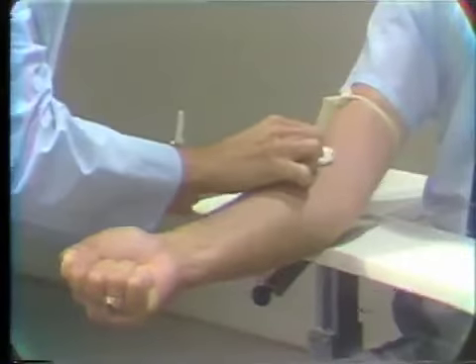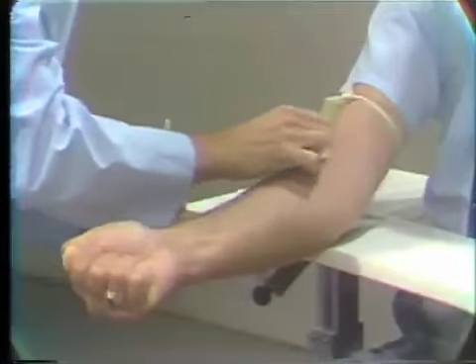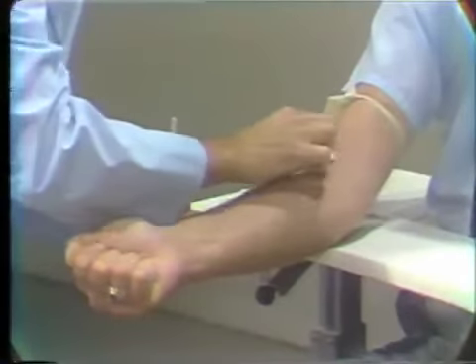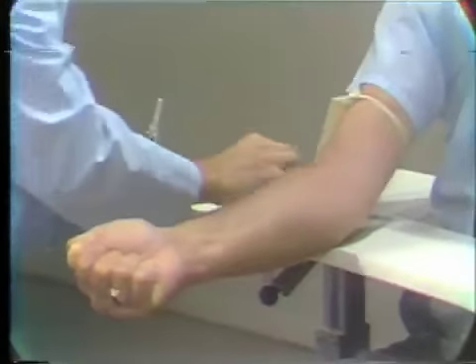After having palpated, clean off the area in a circular motion, not rubbing too hard to set up an irritation or a wheal and flare reaction. I usually then like to dry the area off because the alcohol will sting.